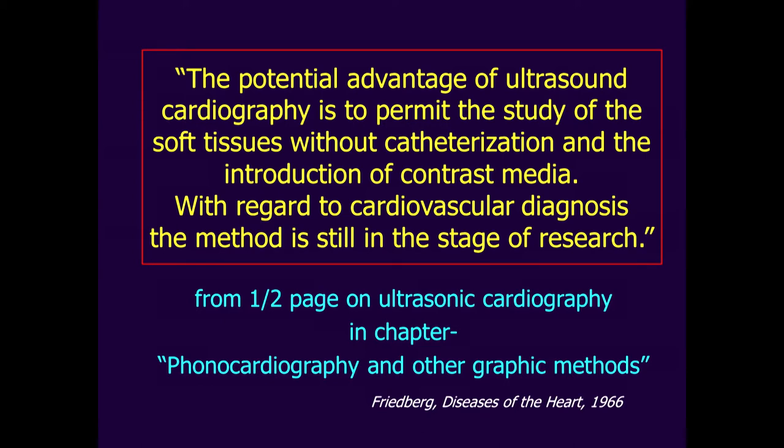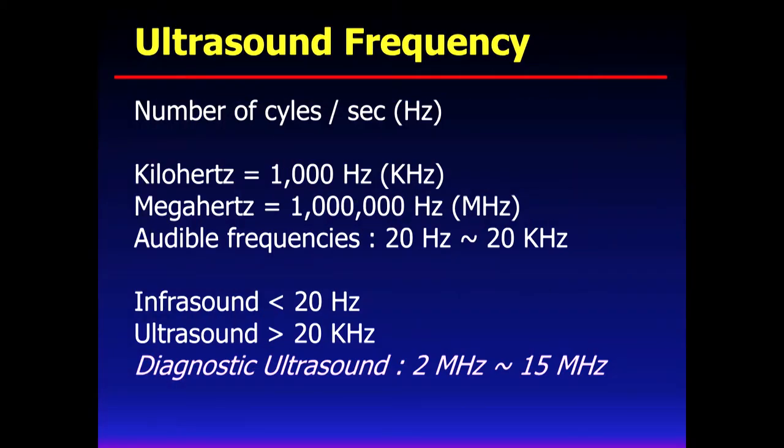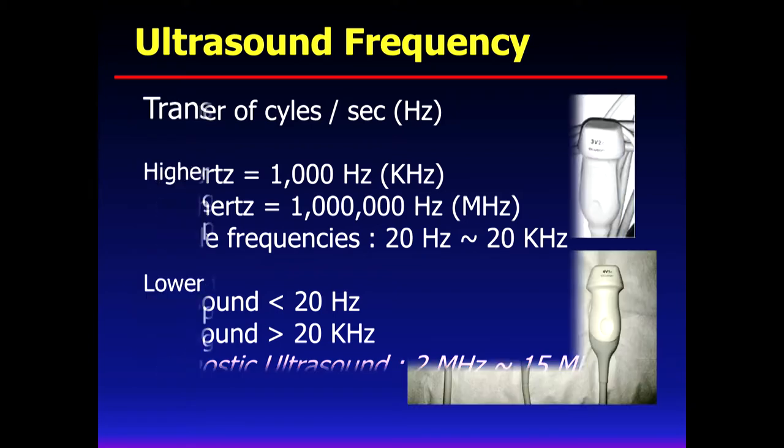And ultrasound frequency, we all know, is the number of cycles per 1 second, so we call that hertz. And then our usage of a diagnostic ultrasound probe ranges from 2 to 15 megahertz. More than 15, 20, 30, some high frequency ultrasound is still used in the research field, but in the clinical field, we use 2 to 15.